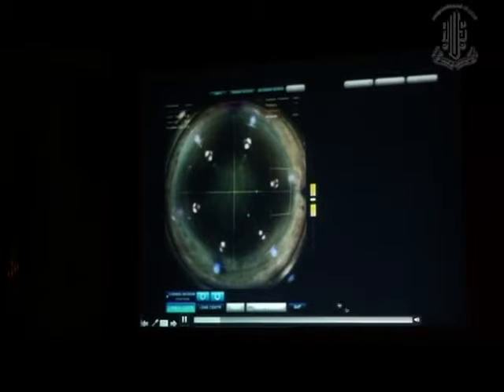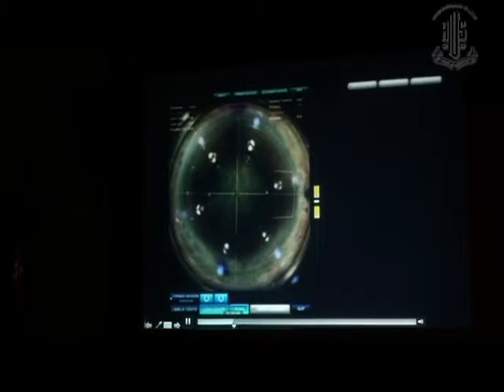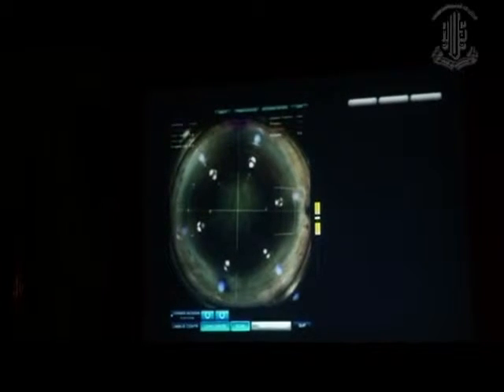Once you have this docking, you can center the capsulotomy, as you can see, and this is a 4-quadrant crack that we are going to do in this particular case. And we will go on to the next step, where we are reducing the size of the capsulotomy slightly.